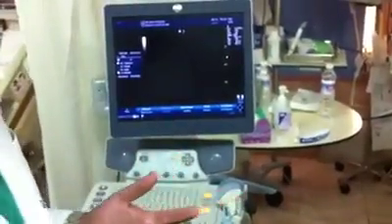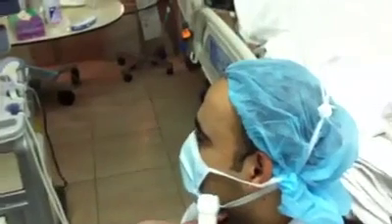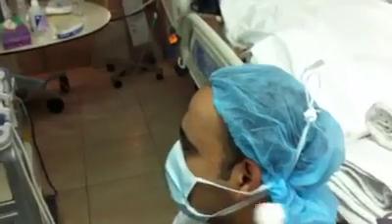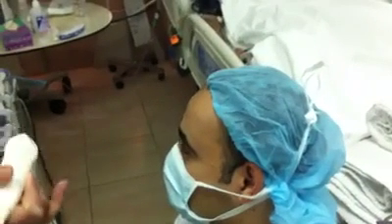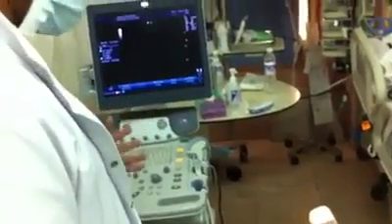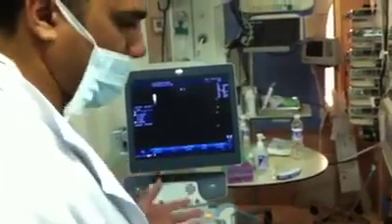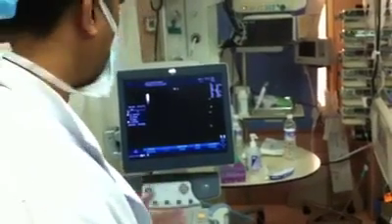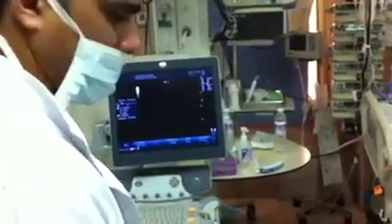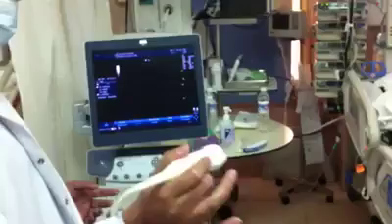First of all, when we start, there are a lot of windows, from temporal to mandibular to orbital to occipital. The point is that everybody's circle of Willis can be seen, number one, if the bone is not ossified. If it is ossified, then you can go for an orbital or mandibular approach to see the carotid siphon. Now the point is how to start TCD.